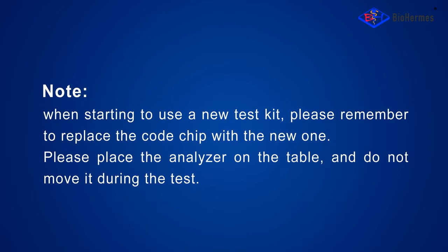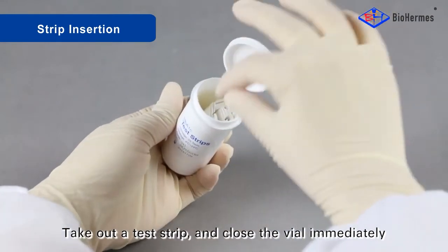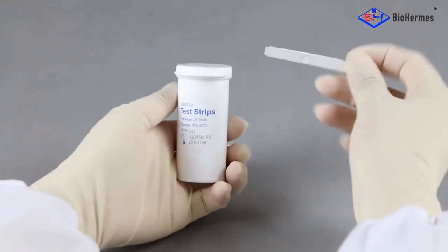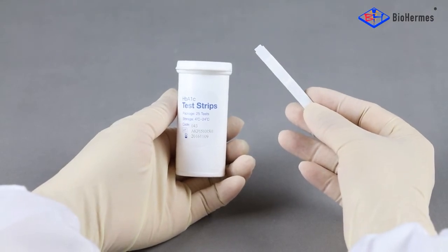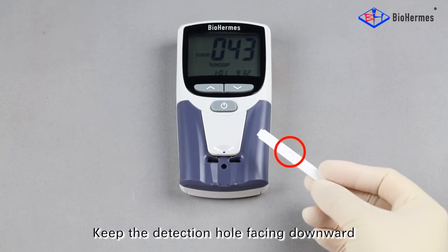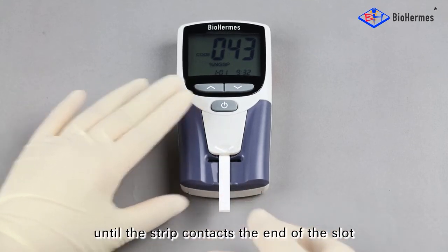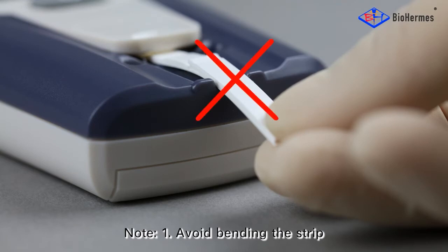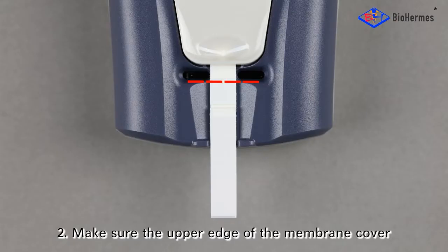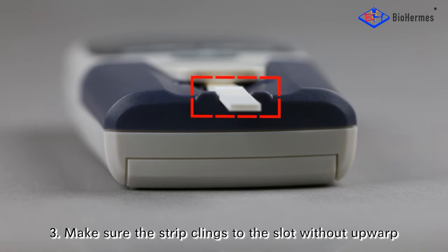Please place the analyzer on the table and do not move it during the test. Next, strip insertion: take out a test strip and close the vial immediately. Insert the test strip with the detection hole facing downward. Carefully slide the strip into the test strip slot until it contacts the end of the slot. Avoid bending the strip. Make sure the upper edge of the membrane cover aligns to the lower edge of the sampler port, and that the strip clings to the slot without upwarp.